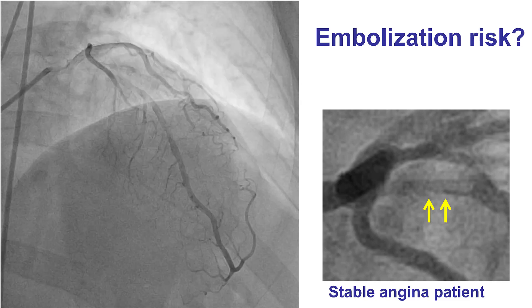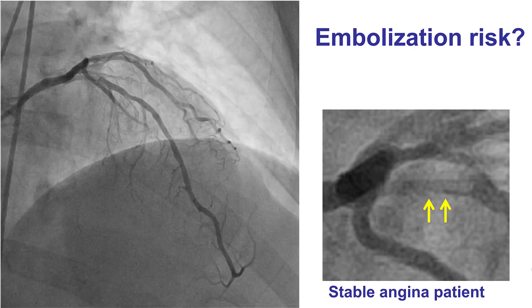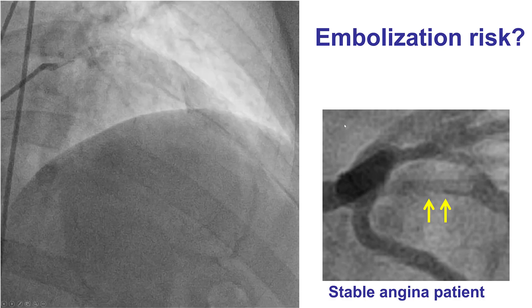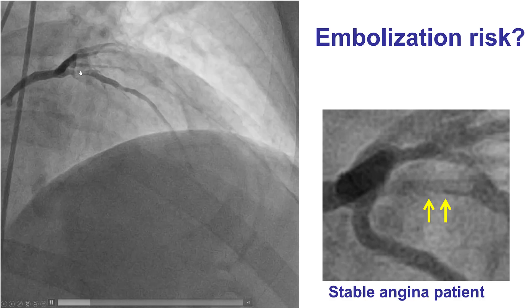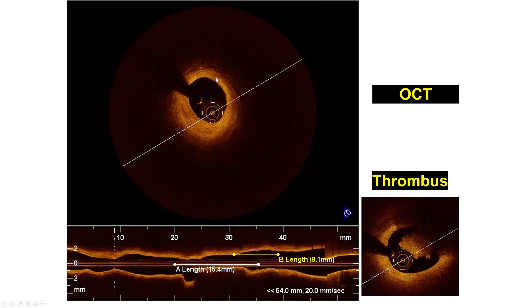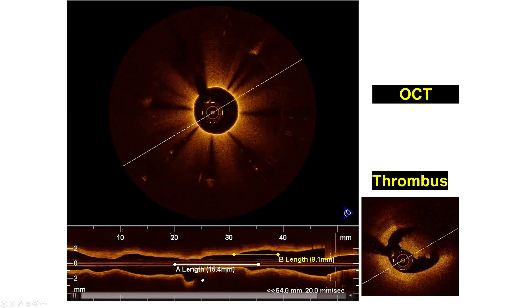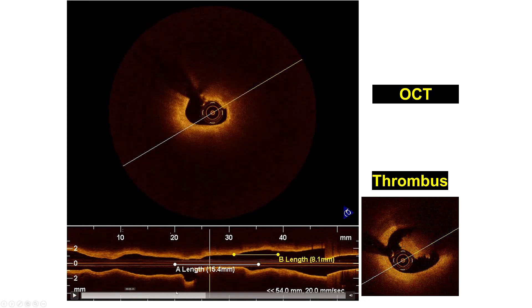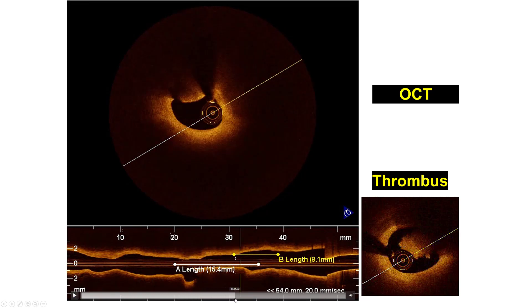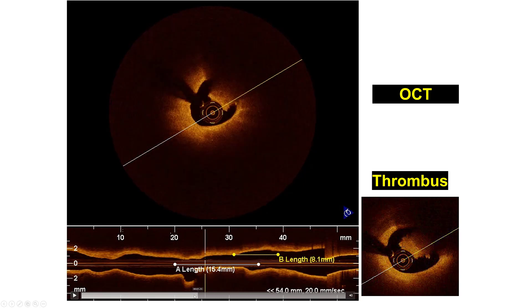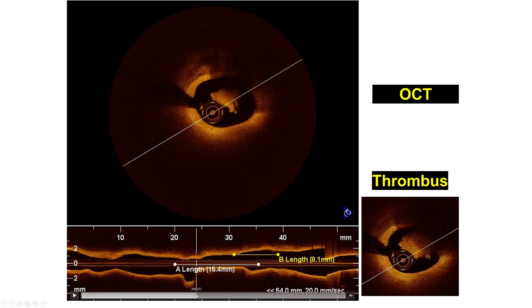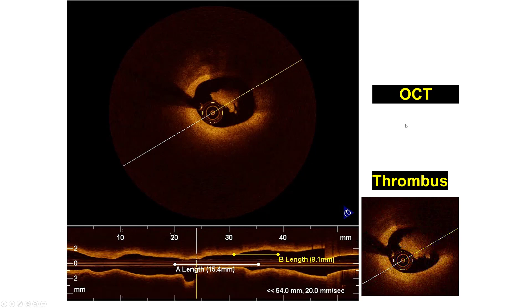The patient had stable angina and was referred for diagnostic angiography. Diagnostic angiography did show a filling defect in the proximal left anterior descending artery. To further evaluate this, we performed optical coherence tomography and found that there was actually a thrombus inside the proximal LAD. That filling defect actually represented intraluminal thrombus, which is fairly unusual in a patient with stable angina.